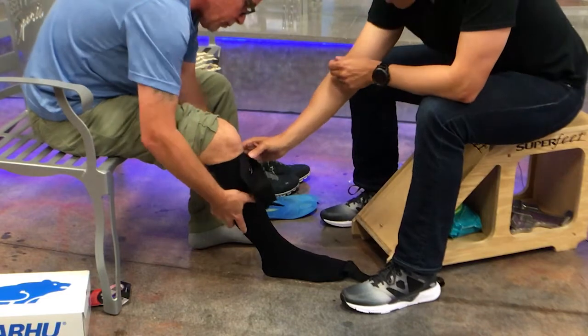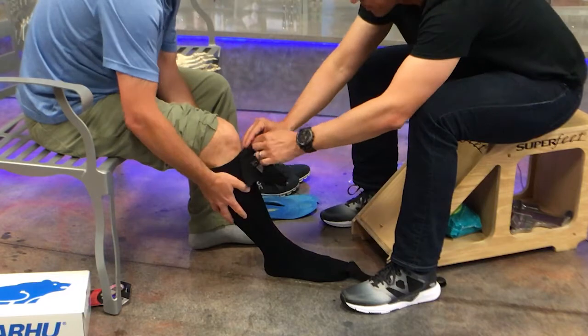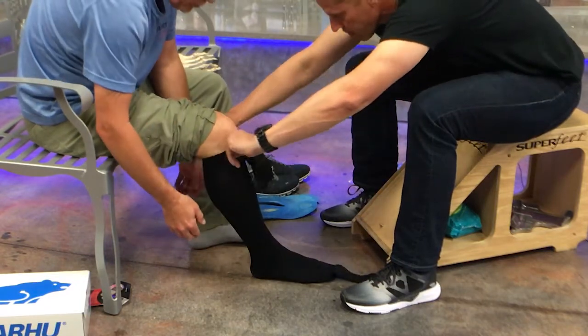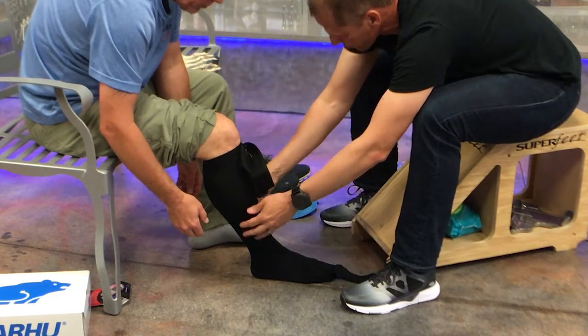If you have any extra material in the top here, what you don't want to do is roll it or fold it in the top because then it can become uncomfortable. So center it like that. And if we have any extra material, we're just going to pinch it and slide it down here towards the middle.